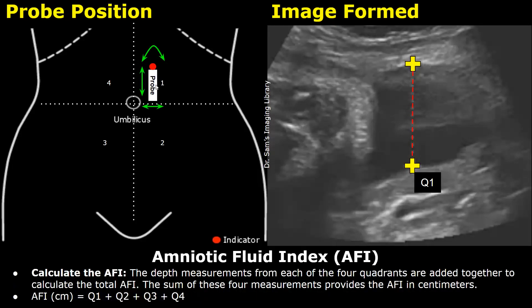This measurement is at quadrant one, which is the left upper quadrant. Move the probe accordingly to find a pocket of amniotic fluid that is free from fetal parts or umbilical cord loops. After you find a pocket, you can take the vertical measurement in this way.